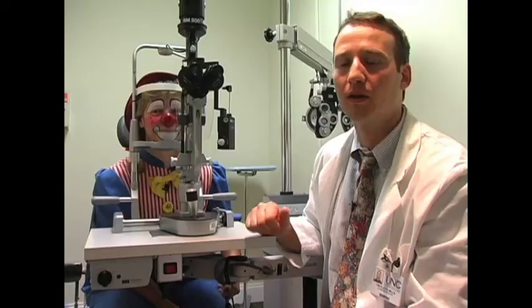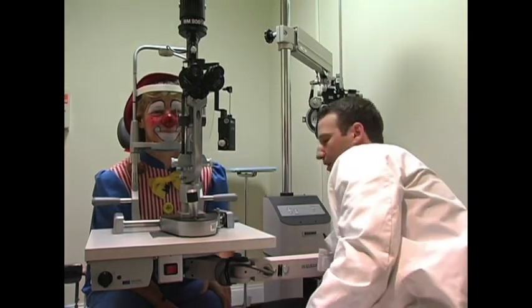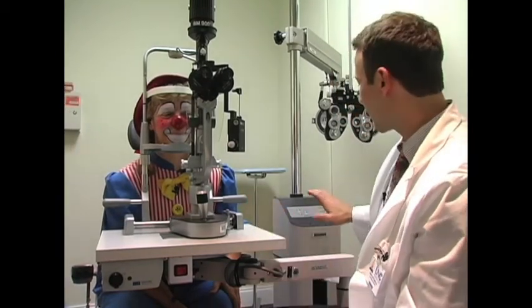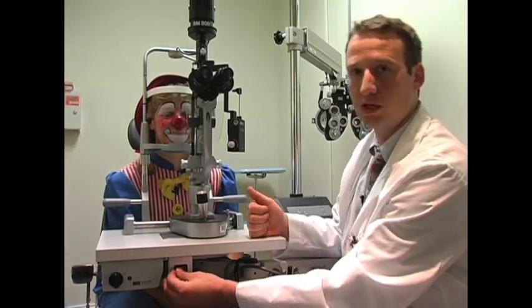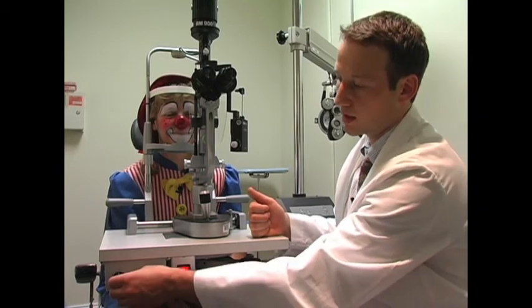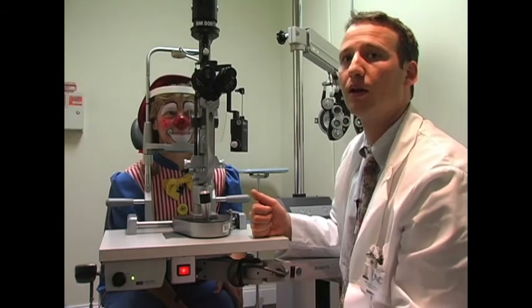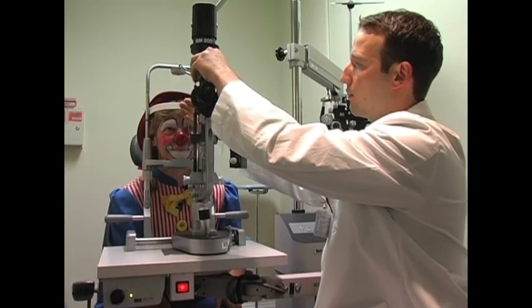One of the most commonly encountered problems with the slit lamp is not being able to turn on the light. This leaves the patient in the dark and leaves you feeling like a clown. First, make sure the slit lamp is plugged into the wall. Then, make sure the plugs along the arm of the slit lamp are connected. If the slit lamp console has an on-off switch, that needs to be turned on. And then the switch for the slit lamp needs to be turned on. The dial for the slit lamp brightness should be turned to half strength or 5 volts. The upper control knob should be switched from the cobalt blue setting to the white light.